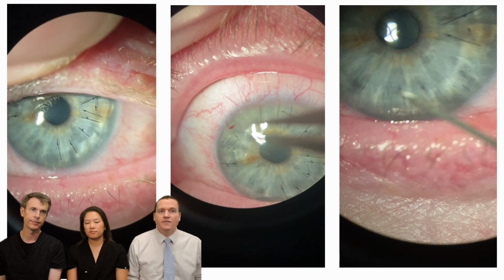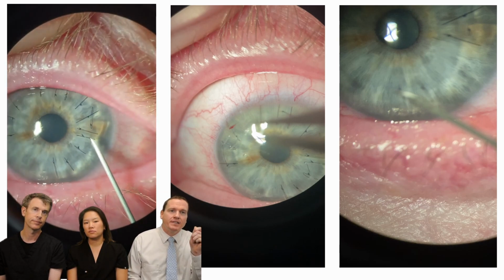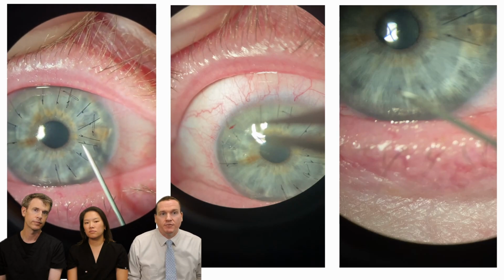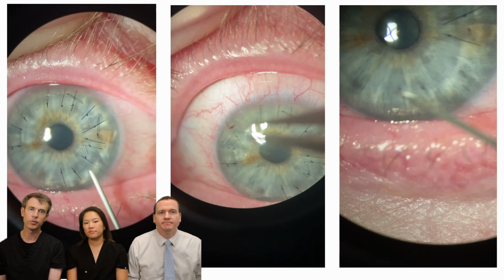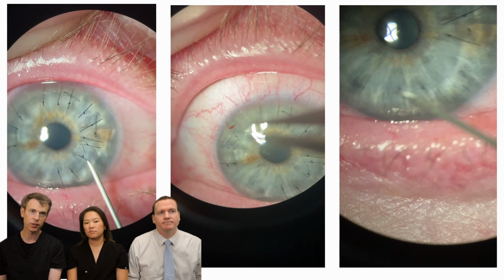This is some video footage of that actual removal process, starting with a needle to try to snip part of that suture, and that'll expose a portion of it to be grasped with some jeweler's forceps and remove it from the cornea. And again, everybody has different techniques. Also make sure that the knot of the suture travels the shortest amount through the tissue. That's at least how I do it.